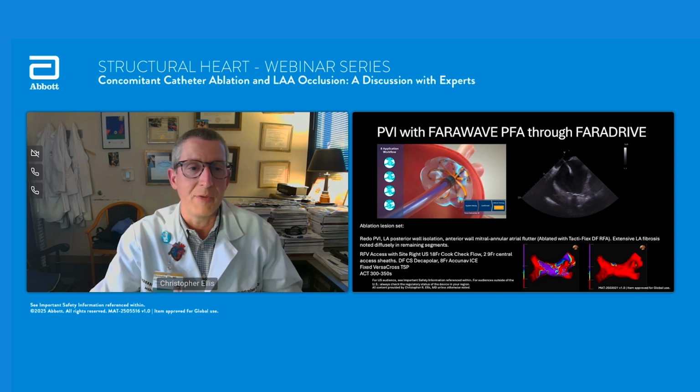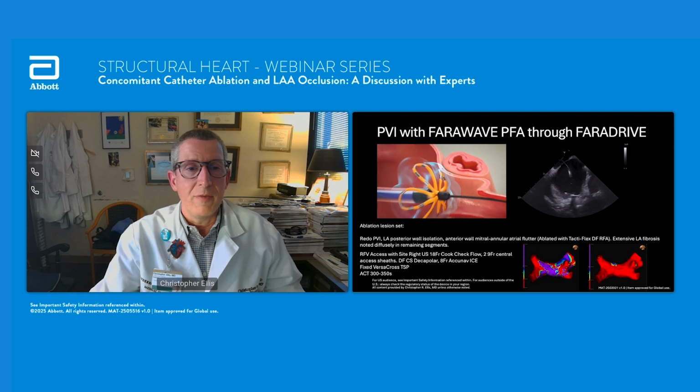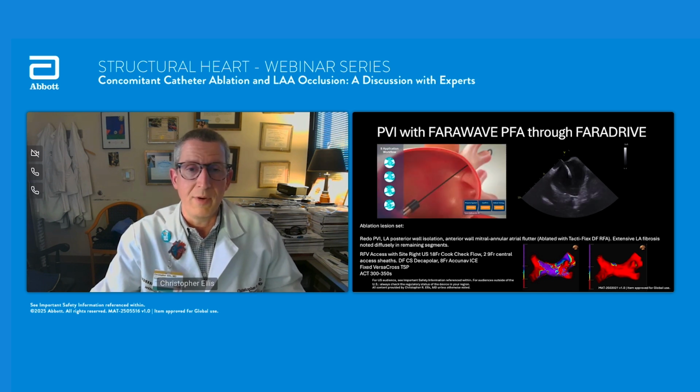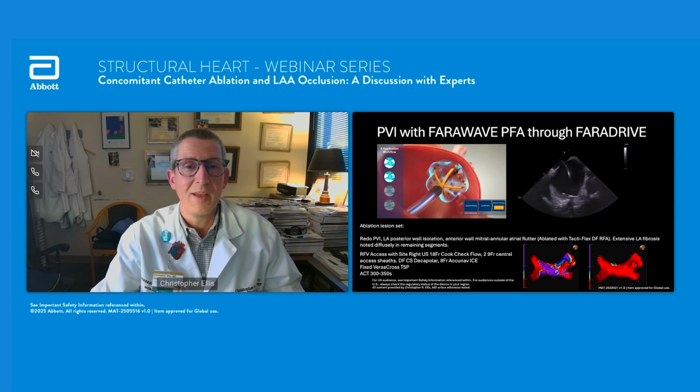In this case, I had atypical flutter. I mapped with ESI. I had FARAWAVE for the PVI and posterior wall portion. And then I'll frequently do the SVC on a persistent patient, and in some paroxysmal patients. This tool works great for SVCs. And then he had presented with atypical flutter on the anterior wall, and we mapped it; a mitral annular line was ablated with a TactiFlex. He did have a lot of fibrosis. I'm kind of surprised, honestly, that his appendage didn't isolate after the anterior line.